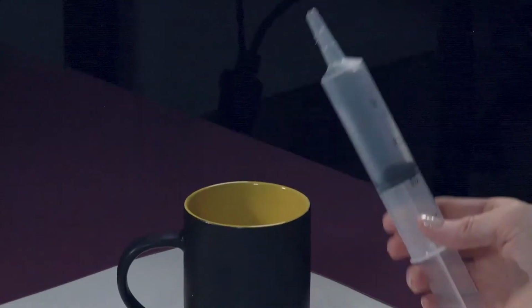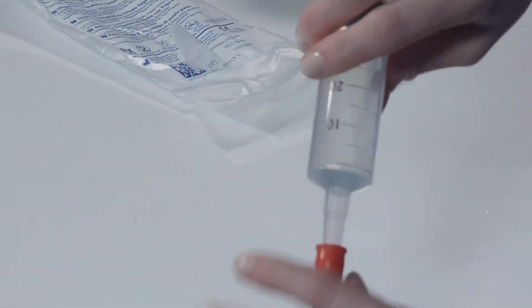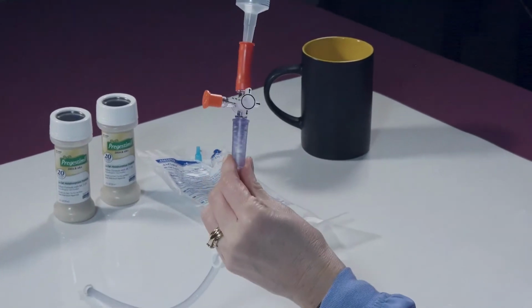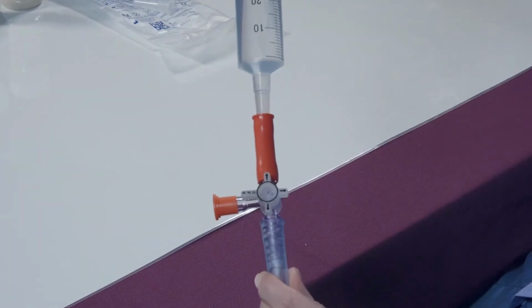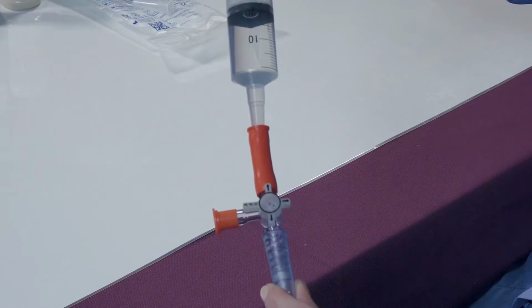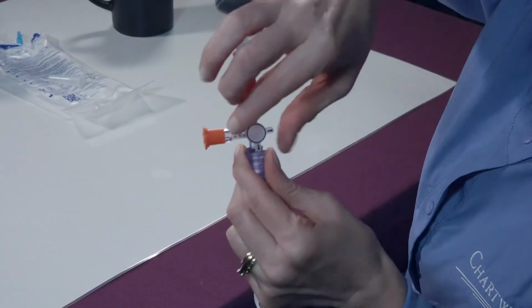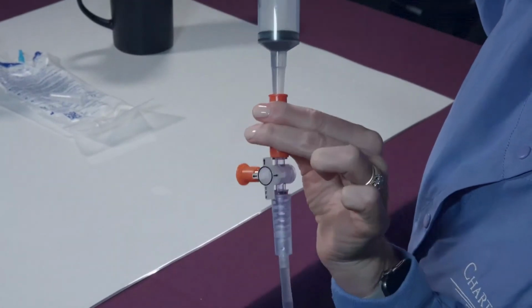You will need to flush your feeding tube with water to confirm that your tube is not clogged. Start by filling your syringe with water as directed. Attach the syringe to the tube or valve connector. If using a valve connector, open the valve and slowly inject the water into your tube. Next, close the valve and remove the syringe.